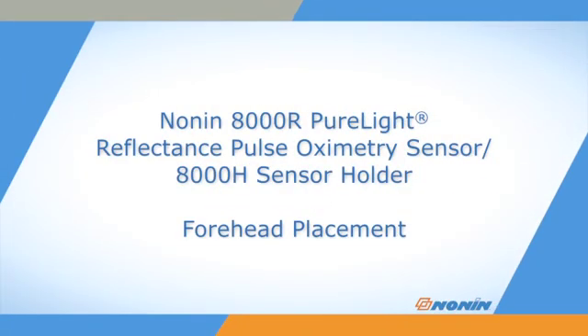This short video shows how to properly position and secure the NONN 8000R forehead oximetry sensor.